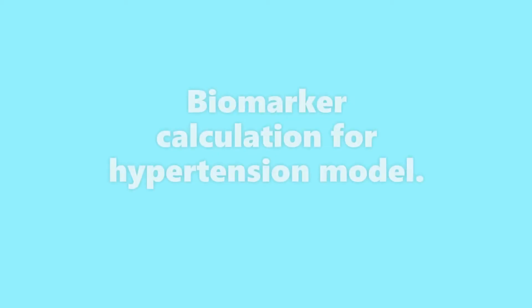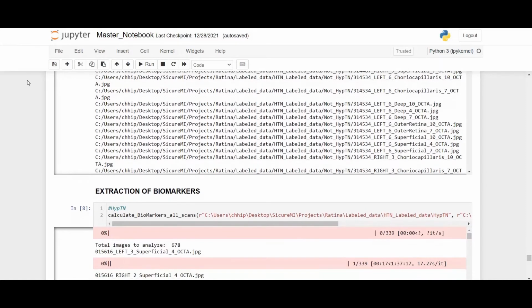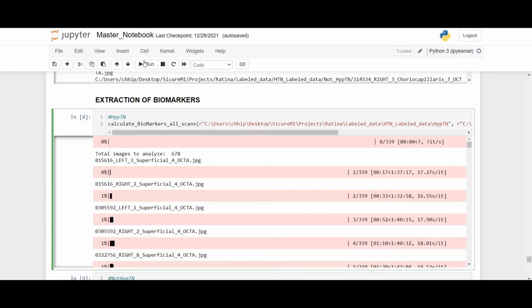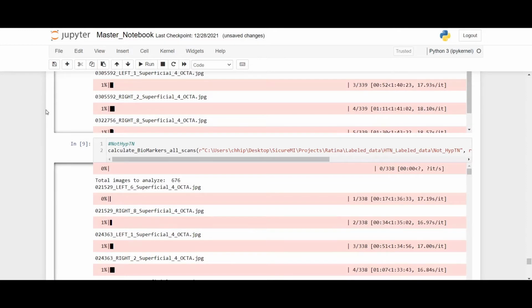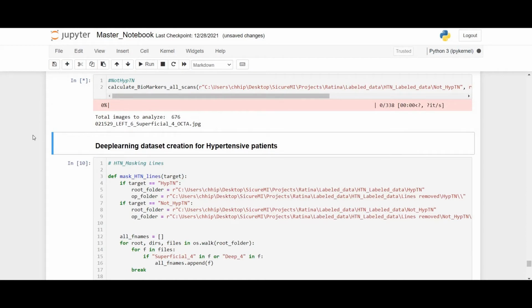After labeling the data, our next task is to extract the biomarkers. In our literature study, we identified 4 biomarkers: area of the foveal avascular zone, FAZ, distortion of the FAZ, flow density, or perfusion density, and vessel length density. Changes in the values of these markers are indicative of hypertension disease. Now we are going to calculate the biomarkers of the patients by running the code in biomarker extraction. First, we will calculate the biomarkers for the hypertensive patients, and then we will calculate the biomarkers for the normal patients. Calculation of biomarkers of hypertension will take approximately 1.30 hours and calculation of normal patient biomarkers will take about 2 hours.